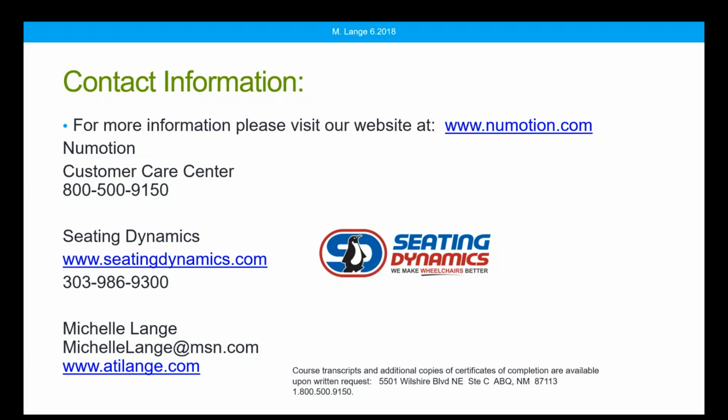What about dynamic seating in a formed seating system, a molded seating system? And Jason, you must be in my area because you've listed an ASO, Aspen Seating Orthosis, and certified, because they're both in this area. You know, I've actually used dynamic seating, dynamic backs quite a bit with molded seats, and since I'm in the Denver area, quite a lot with particularly the Aspen Seating Orthosis.